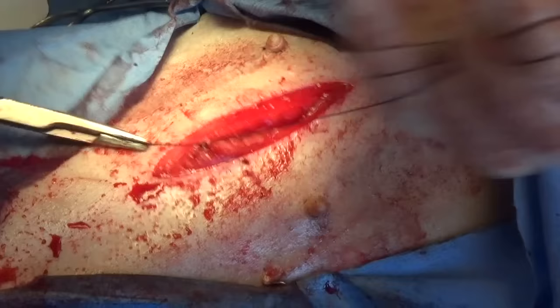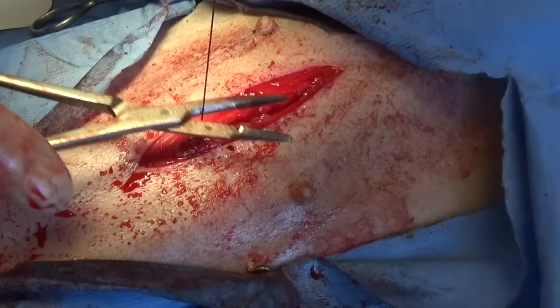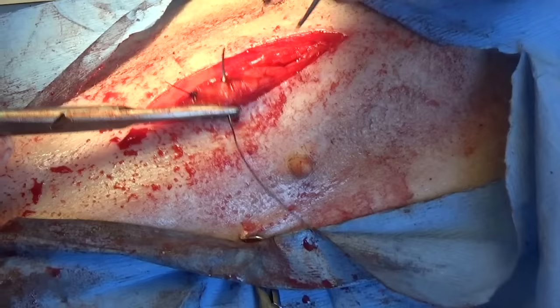I'm not going to tighten it because those little blood vessels going through the muscle don't want to be squished. If they get squished, they don't service the muscle and it could cause the muscle to die, and we want them to live. These sutures are just holding everything close together so they can heal. And unbelievably, in 4 or 5 days, there's already enough scar tissue to really hold it together.